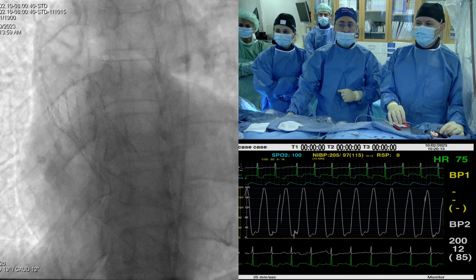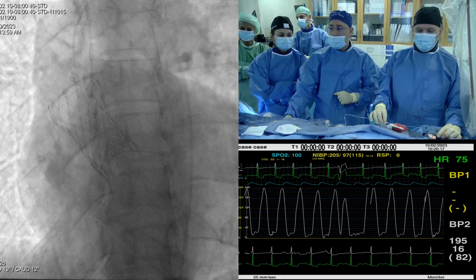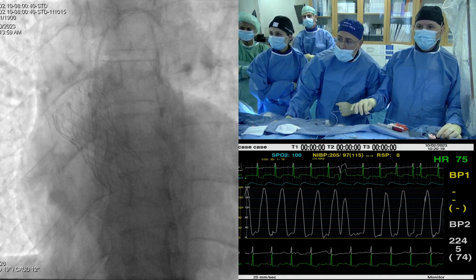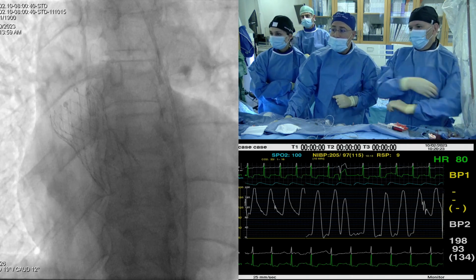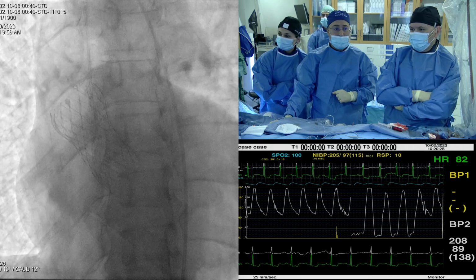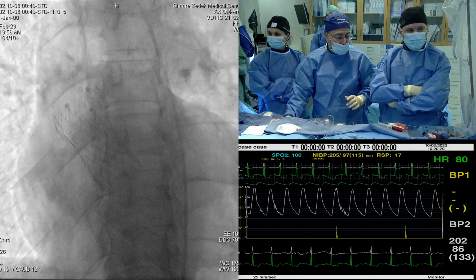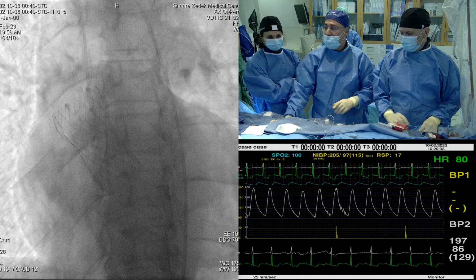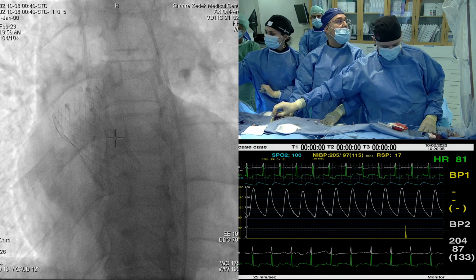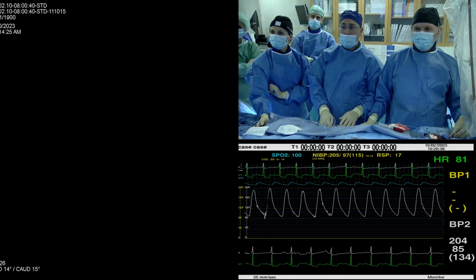Okay. Very impressive, and it appears, Danny, that you were right. That the 29 indeed provided us with excellent sealing and excellent hemodynamics. Let's do an injection. Maybe we'll show you an injection and then you can go to Toulouse and see their interesting case.